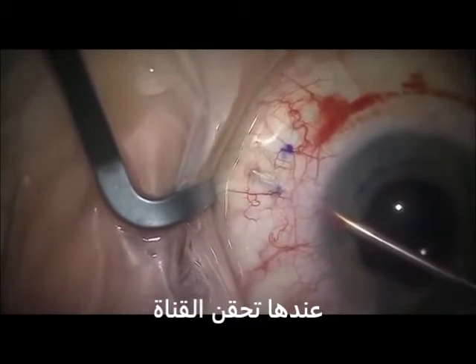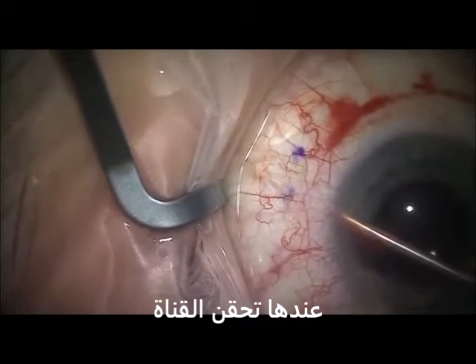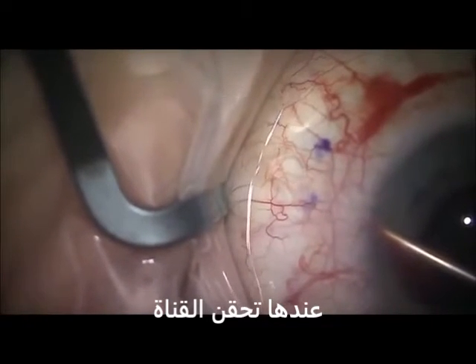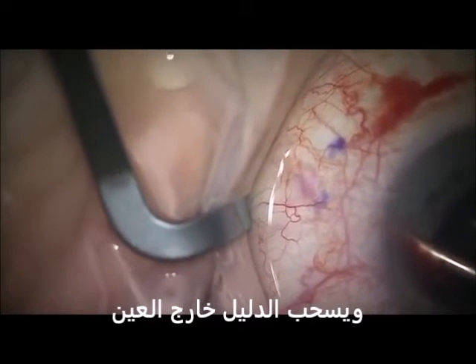To deploy the stent, rotate the knob on the back of the injector in a counterclockwise fashion, continually keeping pressure on the angle. There is a sleeve to prevent the needle from going any further and to avoid being too short in the sub-conjunctival space. Complete counterclockwise rotation to deliver the gel stent and slowly move the injector straight back, then exit the eye.